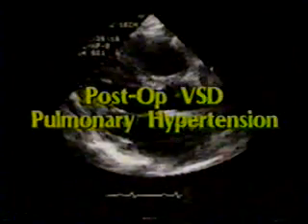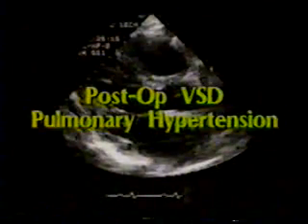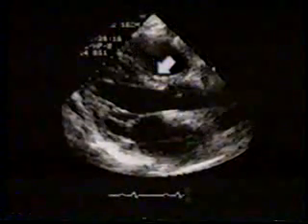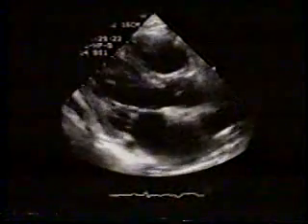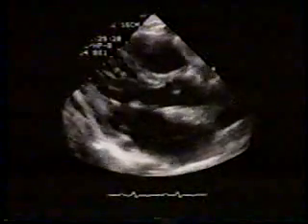This 17-year-old patient had ventricular septal defect repaired at age 5. He now presented with symptoms and signs of pulmonary hypertension. This is the parasternal long axis view. The right ventricular cavity is enlarged. Here is the hypertrophied trabeculum in right ventricle. The ventricular septal patch appeared intact. Observe these in real time and note that the left ventricular cavity size is normal, but systolic function is also reduced in this patient.